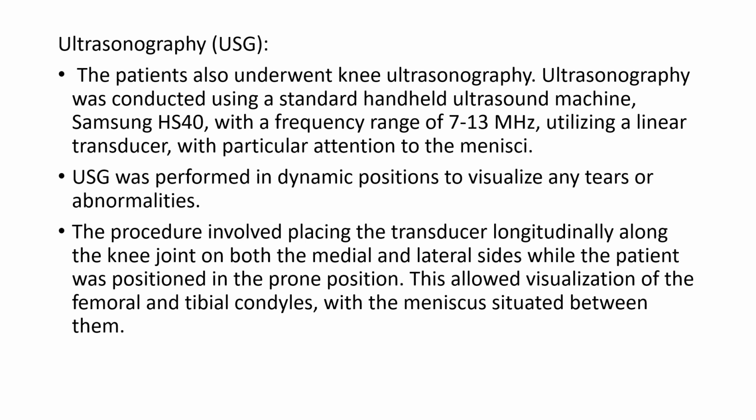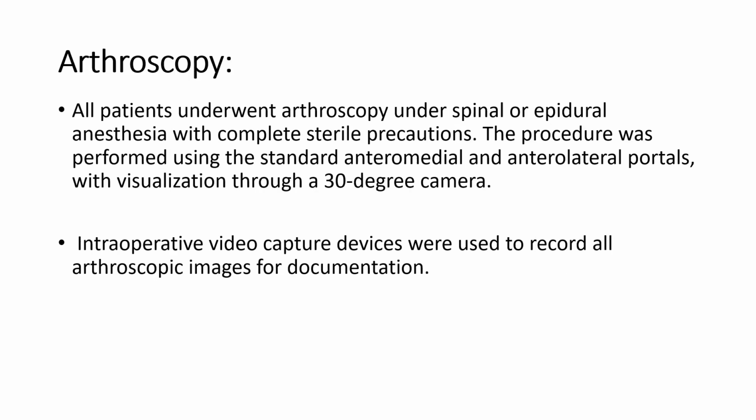It was performed in dynamic position to visualize any tears or abnormalities, and the procedure involved placing the transducer longitudinally along the knee joint on both medial and lateral sides while the patient was positioned in prone position. It allowed visualization of femoral and tibial condyles with the meniscus situated in between them.